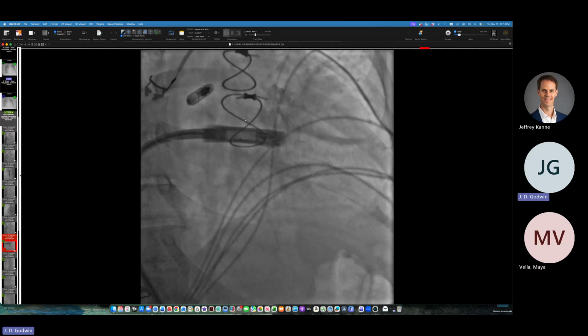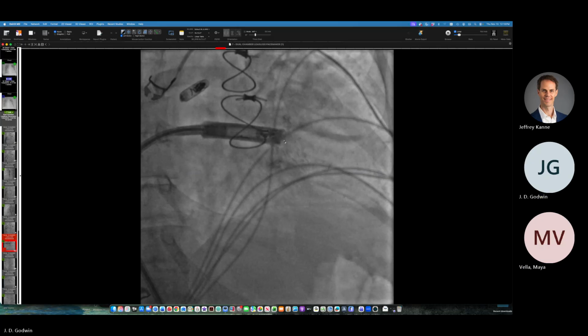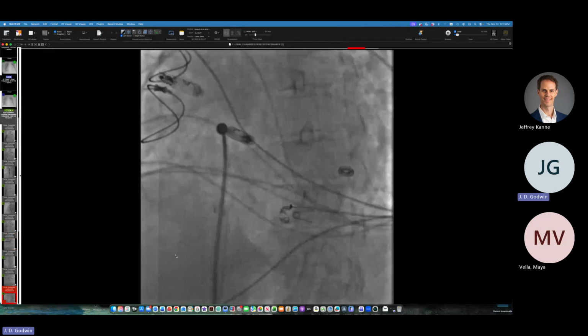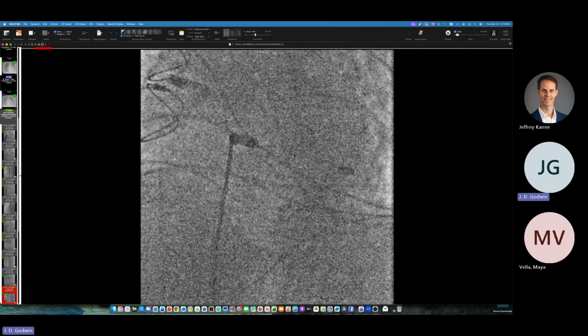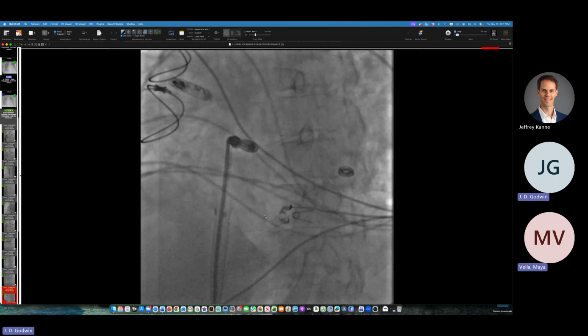Here's the atrial one floating up there. And the ventricular one's going to be plugged in here. And this is the wire and catheter that is installing the thing. So let's see what ended up at the end. There it is, seems to be in place there. So you can see the orientation at this point is fairly horizontal and it was flipping around later on.